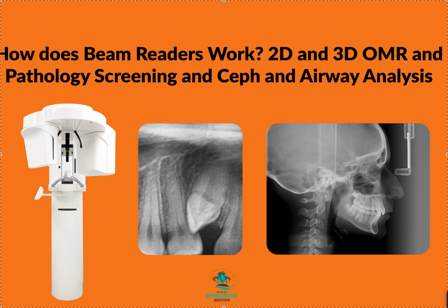I want the all clear from a dental licensed OMR or a maxillofacial radiologist to tell you, yes, it is okay for you to treat even though there's a supernumerary, or even though there's an odontoma in that area, or even though there's some condensing osteitis around that area. It's okay, you can go ahead and move the teeth. You want to have that in writing from the OMR.